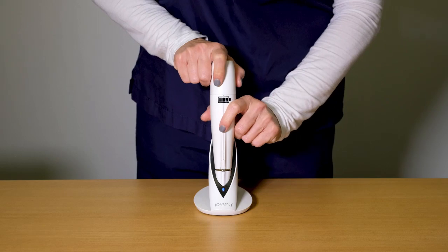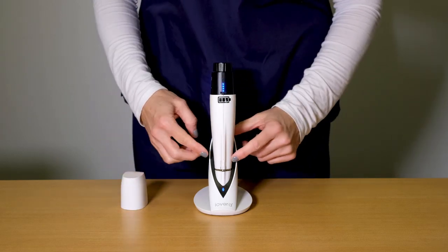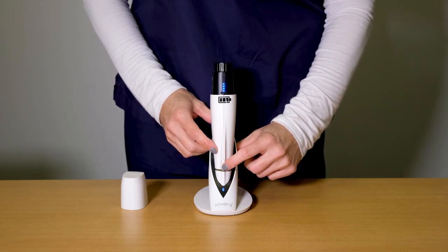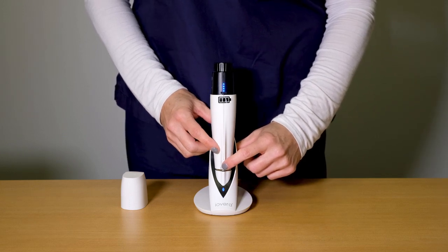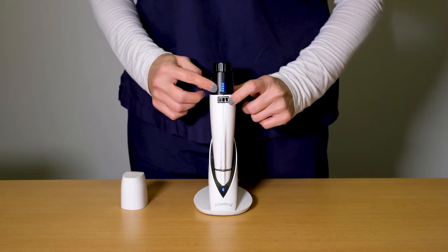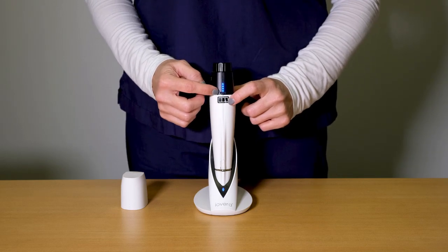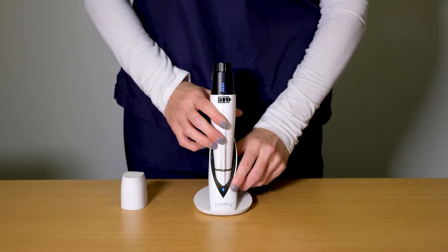Remove the handpiece cap to reveal the top of the iOVERA handpiece. On the front of the handpiece is the start-stop button. This button powers on the device as well as begins priming and treatment. To power on the handpiece, hold the start-stop button for two seconds. The battery sticker indicates the front of the device and the battery status LEDs. Do not attempt to begin a treatment with less than three of the battery status LEDs illuminated.